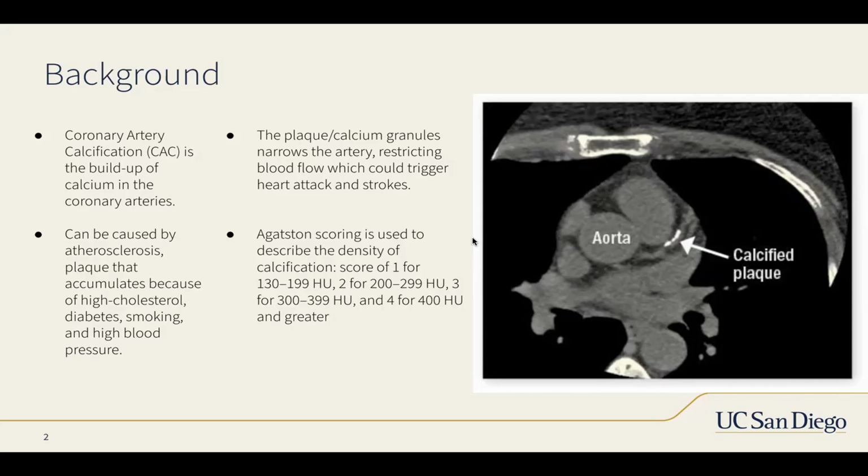And these are measured in Hounsfield units, but also Agatston scoring, which is also based off of Hounsfield units. And you can see these are the ranges for the scoring.